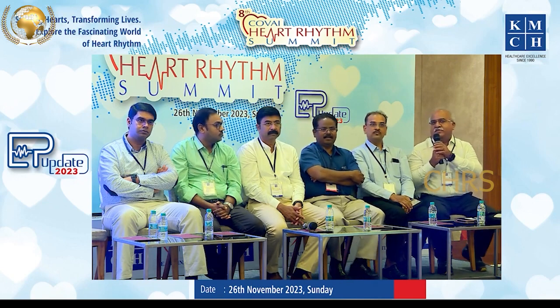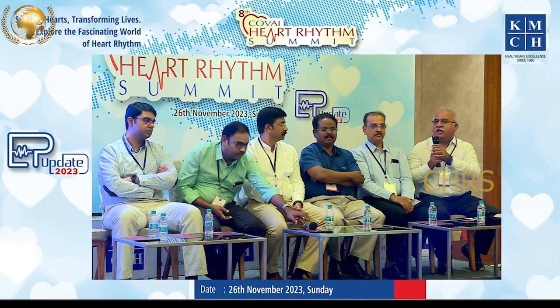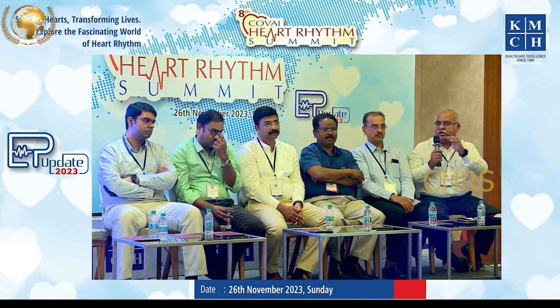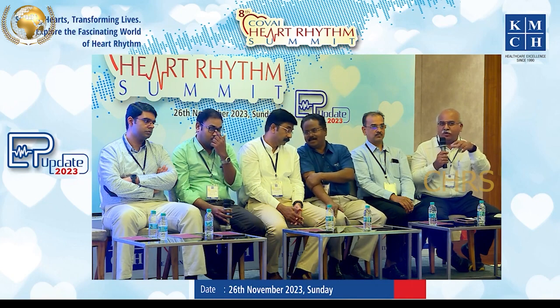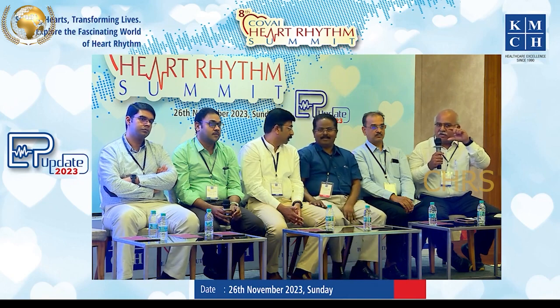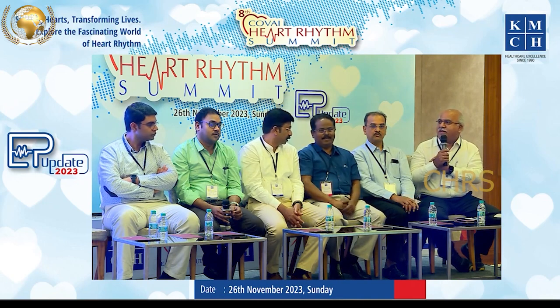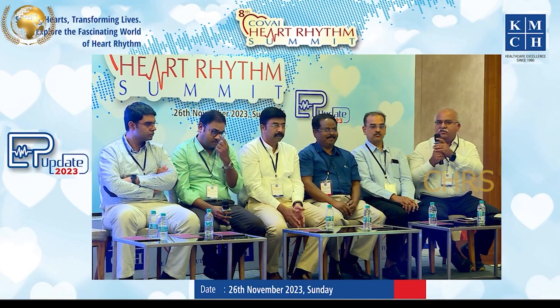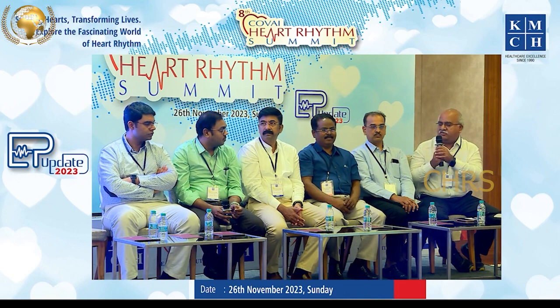Practicing in a rural area is sometimes really challenging. We have very nice equipment in corporate hospitals, GE machines, Philips machines, whereas in rural areas you get ECGs from government hospitals where they don't take care of standardization. Many a time the standardization is not correct, and they get very small complexes or very large complexes, and the medical officer there gets frightened and refers it immediately as MI. So my suggestion to my colleagues is check the standardization every time, and also check your machines to see if the standardization is correct.